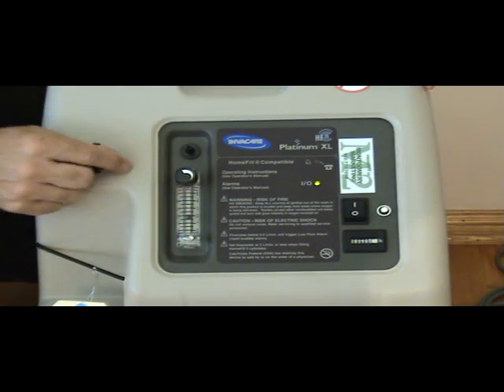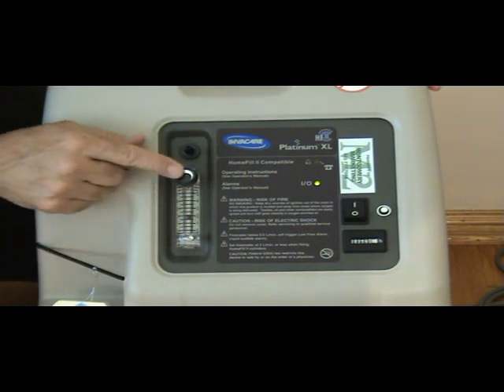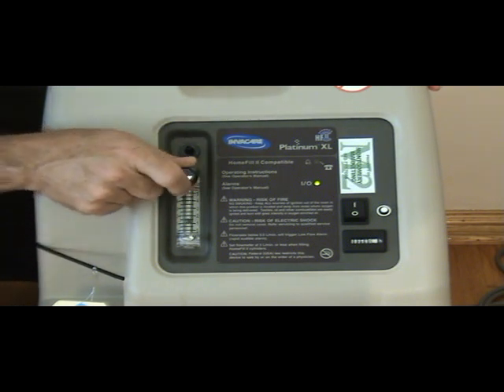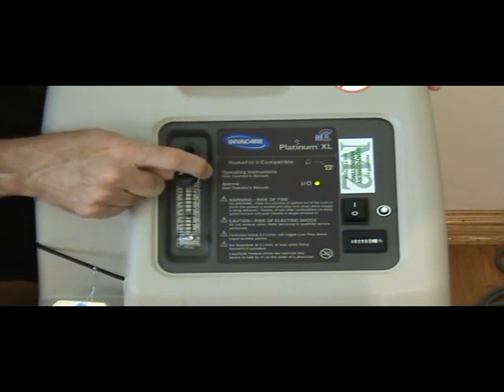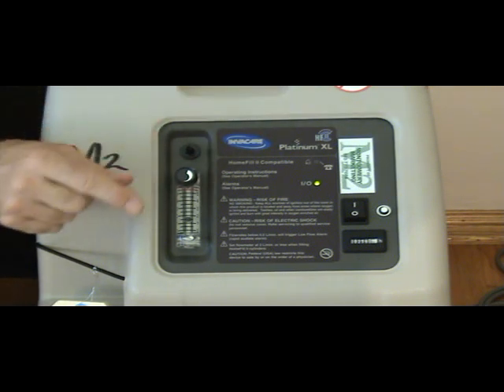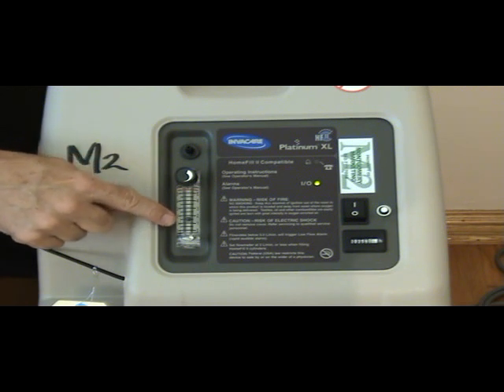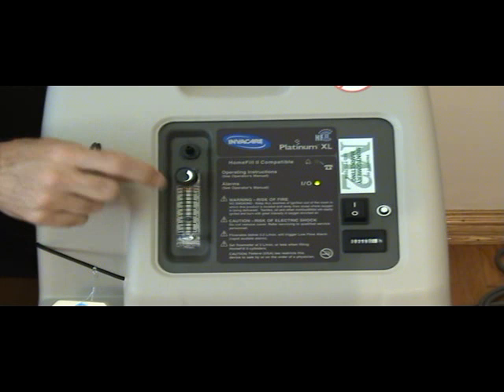The way that we change the flow for the meter, and right now it's set at about 2 liters, is with this knob here. When you turn it, you can see the ball going up and down in the flow meter. What you want to do is position the ball so that it intersects the line wherever you want the flow to be set. So if it's at 2 liters, the line at 2 should intersect the ball right in half.